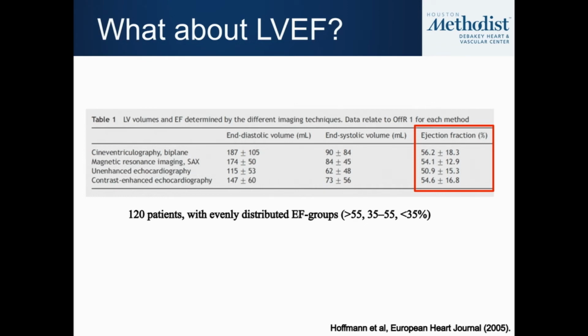But for what it's worth, there's good correlation between all modalities, at least in this study, which included people with low EF as well.